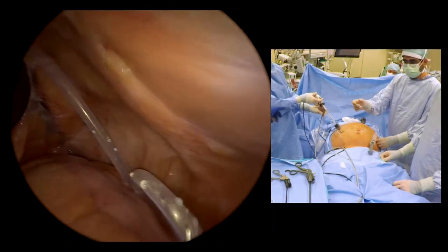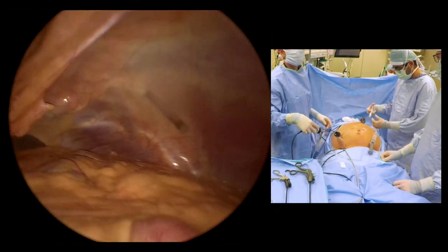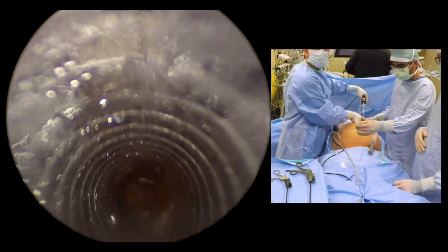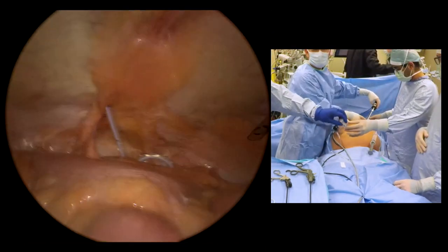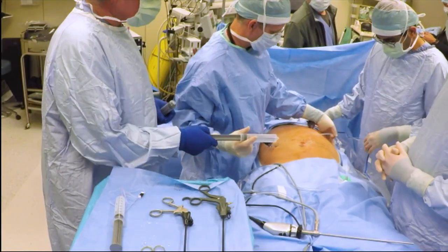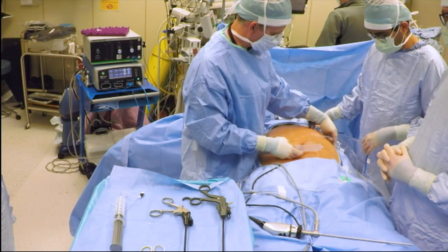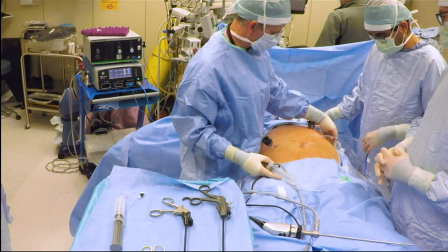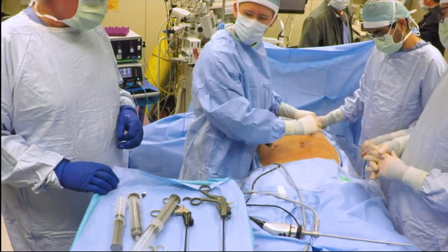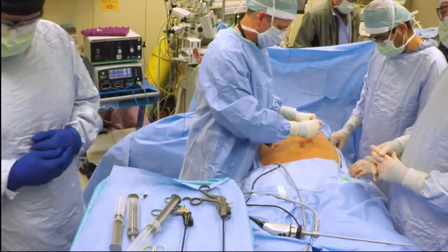Local anesthetic is applied to our port site. With the abdomen desufflated, we confirm resistance-free inflow using sterile saline and monitor for drainage from the pelvis to ensure catheter patency. Lastly, the catheter is packed with heparinized saline before applying a plastic cap.